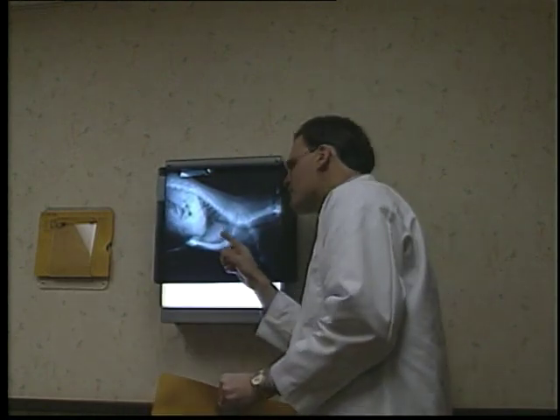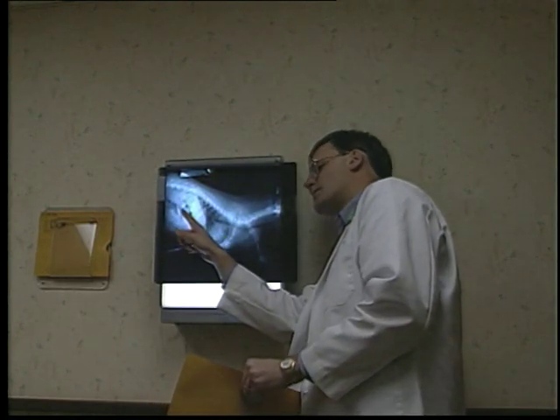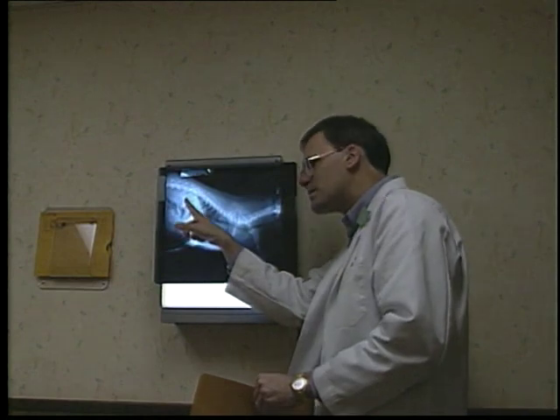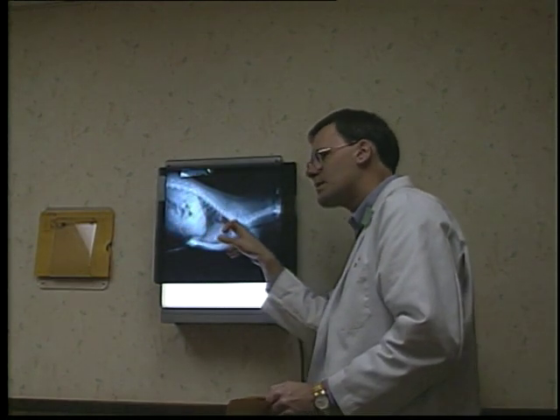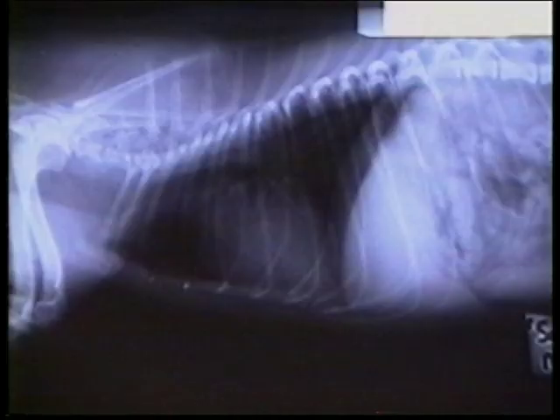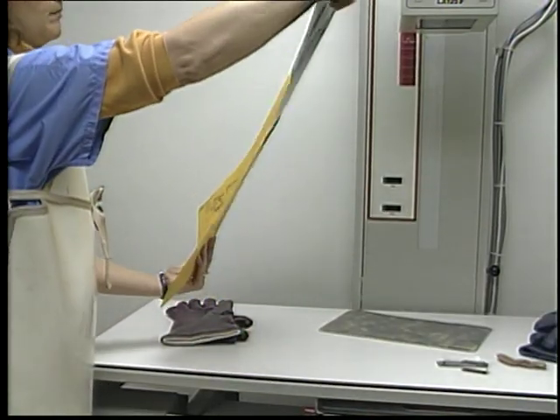Once the films are developed and dried, they are ready to be read by a veterinarian on a lighted view box. Radiology has allowed veterinarians to see within the body and diagnose conditions such as bone fractures, heart disease, foreign objects in the digestive tract, and much, much more.